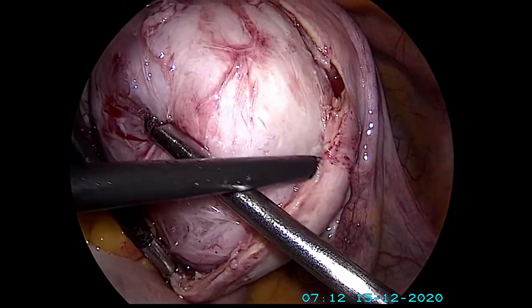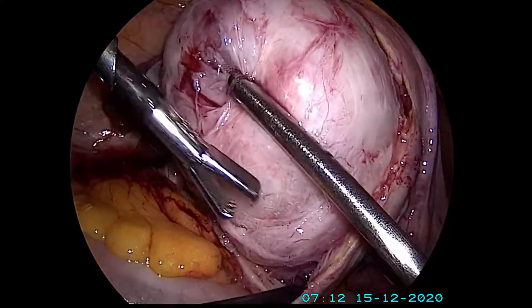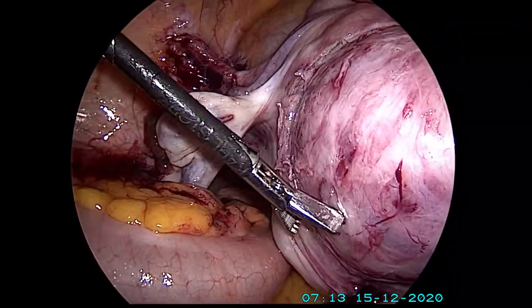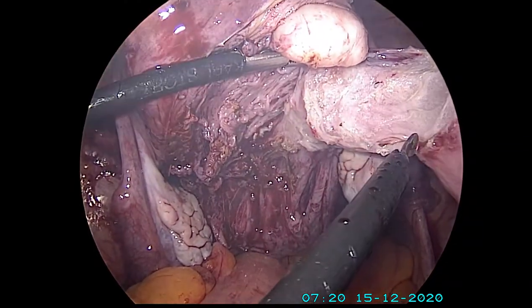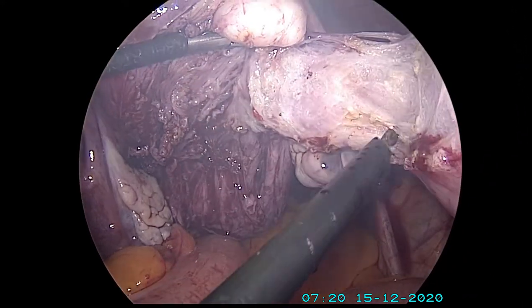Of course, it's not just about doing the surgery — it's also about making sure that there are no risks, no complications, and making it very safe for the patient. Such big fibroids are definitely very difficult to handle initially unless you're absolutely trained. Here you see the fibroid on the right side is being cut off from the uterus using an electric current, so the last few fibers of the fibroid now remain.